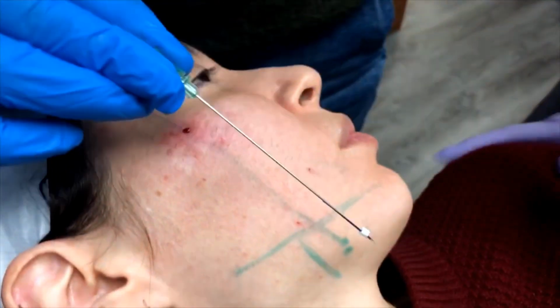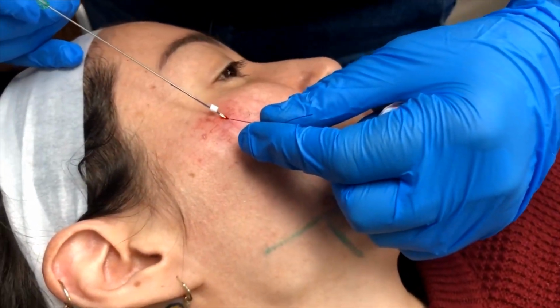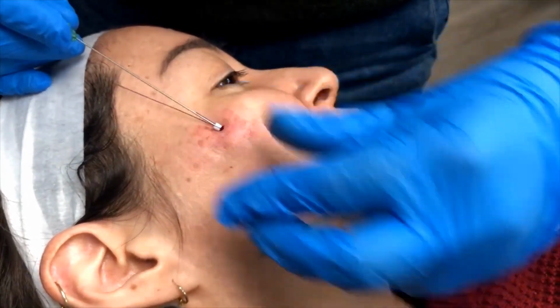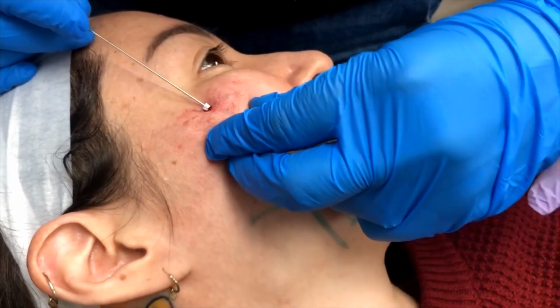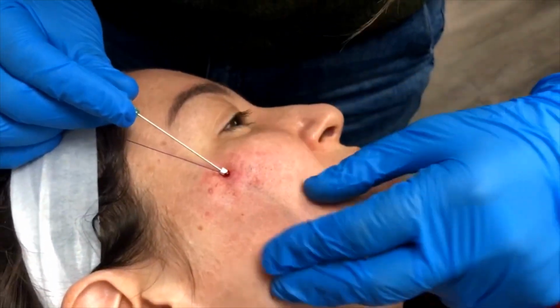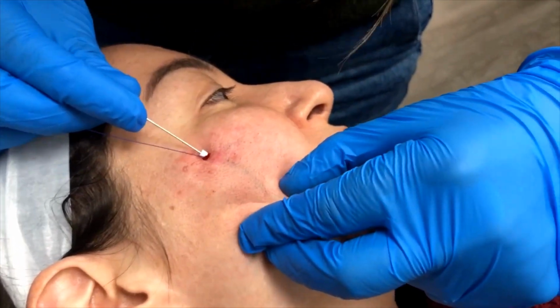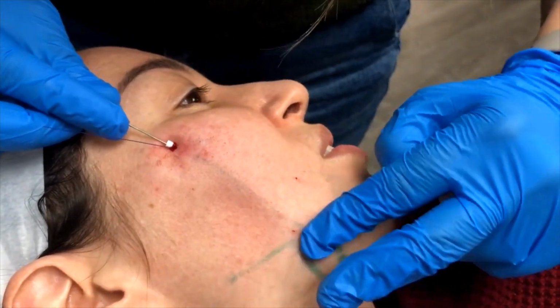Now we're going to go down another thread, and these angles you'll learn in the AFE certification training, exactly the vectors that work the best, and the PDO thread that works the best, and that's the V-Soft Lift. It's about 25% stronger than any other PDO thread on the market. So again, we're going to place it in the right plane, and we are going to use our other hand, curtain over the curtain rod. We're not shoving it in, we're pulling the tissue over it, and we're feeling exactly where we want it.